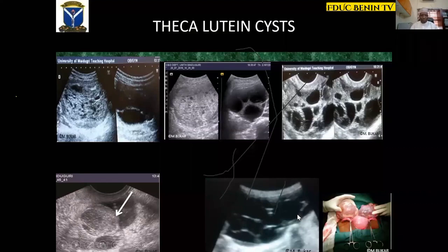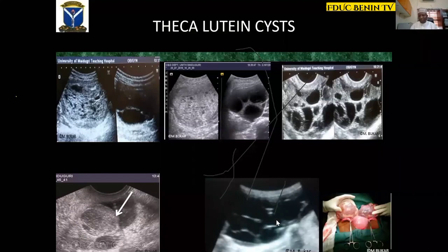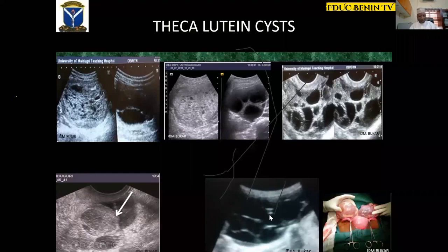Not so for another patient whose ultrasound image was mistaken for bowel obstruction, and she was taken to theater — only to discover she had theca-luteal cysts. But if you look at the image clearly, it is not different from the typical appearance. The appearance of theca-luteal cysts is classic. Bowel will not have clear contents; if you are patient enough, you see evidence of peristalsis. If you apply pressure, bowel will collapse. These are ways you can differentiate between bowel and cysts if in doubt — but if still in doubt, please ask for help or a second opinion.